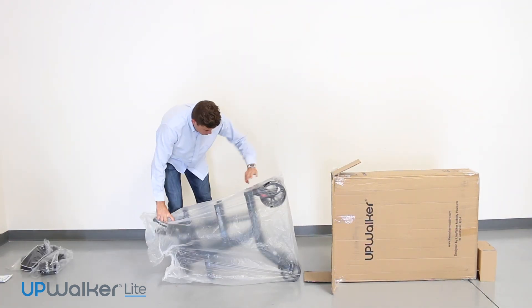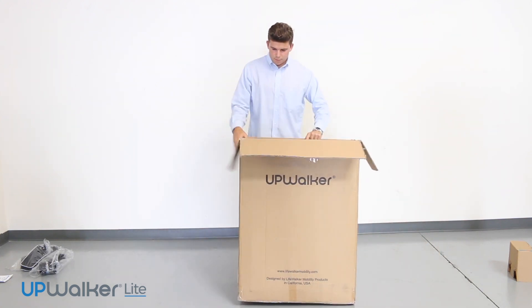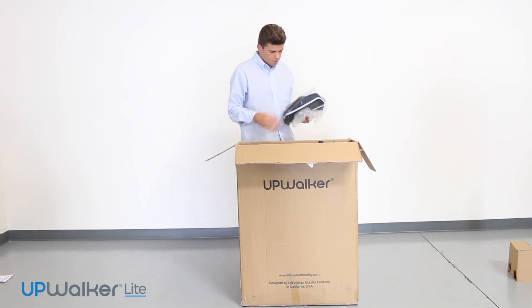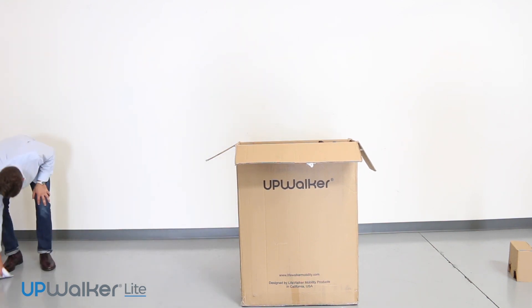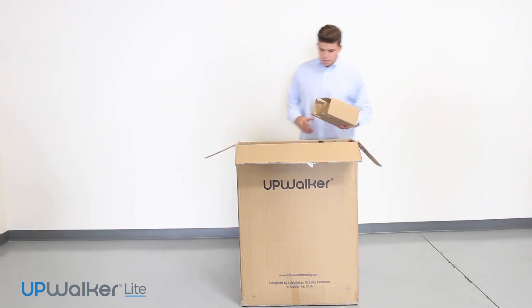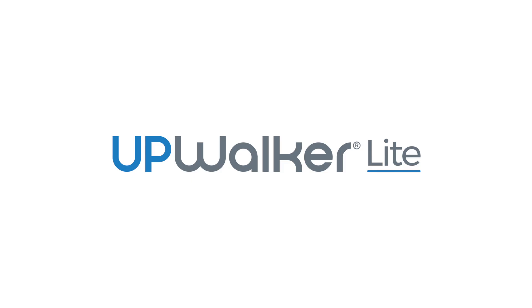Next, you will put all of the accessories inside the plastic bag in the box. Then you will put the protective cardboard between the hand grips and the top of the box. Please ensure the UpWalker Light is returned in like-new condition.